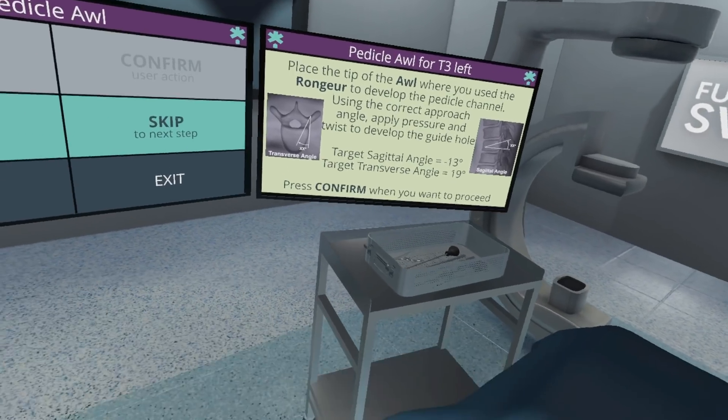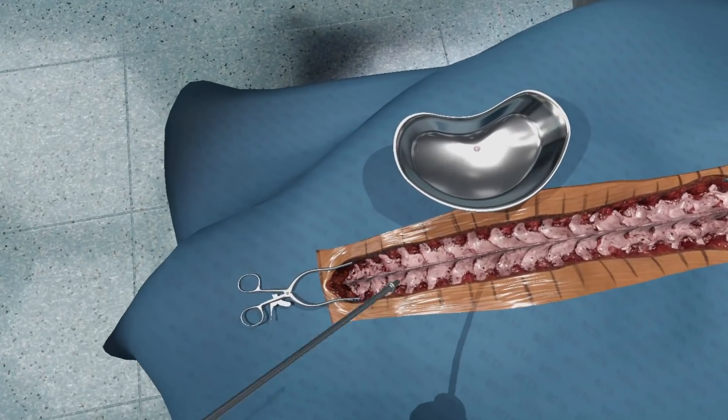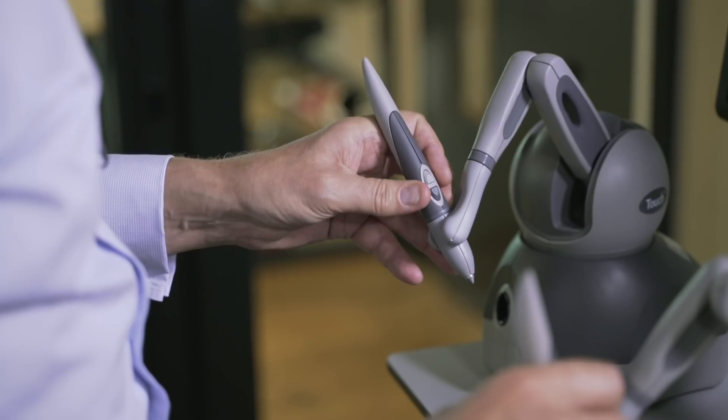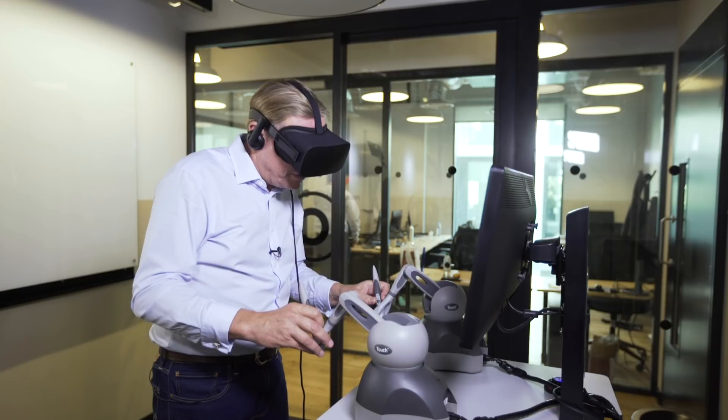Next I enlarge the hole I've just made with the rongeur. There, that's nice and enlarged.